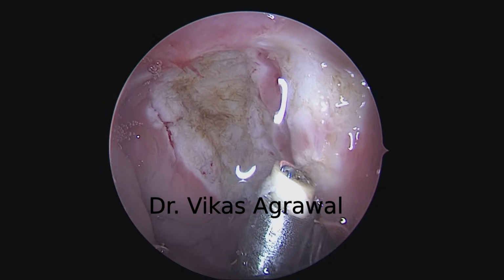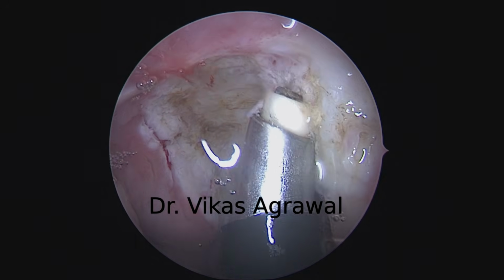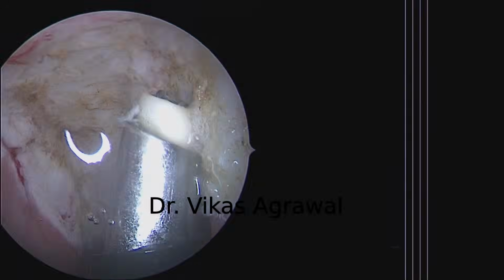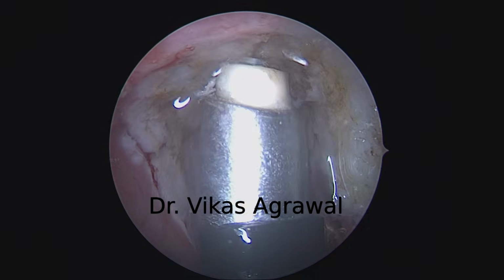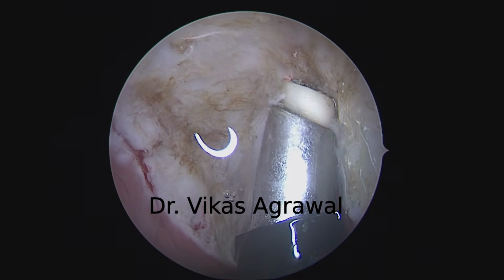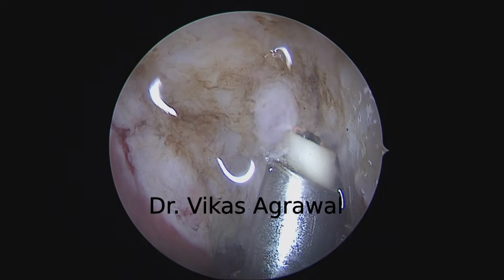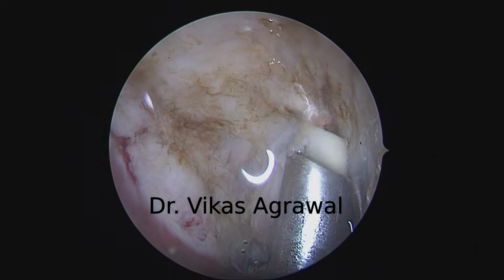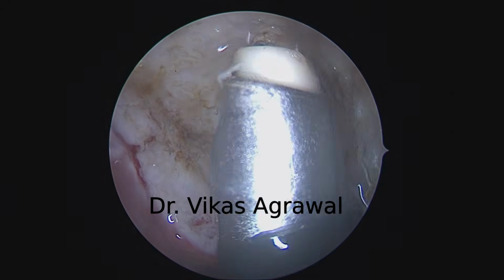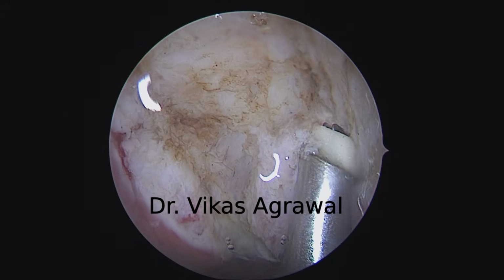And I'll follow the trajectory and go to the lateral boundary posteriorly, which is the fossa of Rosenmuller. This is the fossa of Rosenmuller. This is the superior boundary. That's the fossa of Rosenmuller, the lateral boundary posteriorly. And you can see how much tissue is still lying over there. That gives the postnasal drip and earaches and all those things.